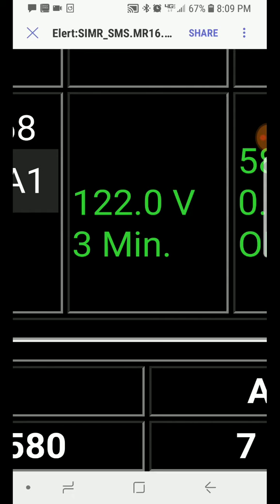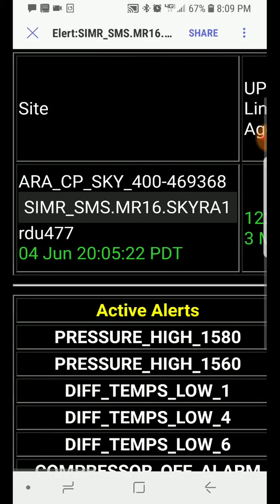If power goes to 0 and the UPS is on battery, then this will go to 0 volts. This is our best indicator of 480 power. So this is the last time that the MSUP communicated to the RDU. It stops communicating when you're scanning. It also stops communicating when it loses 480 power.